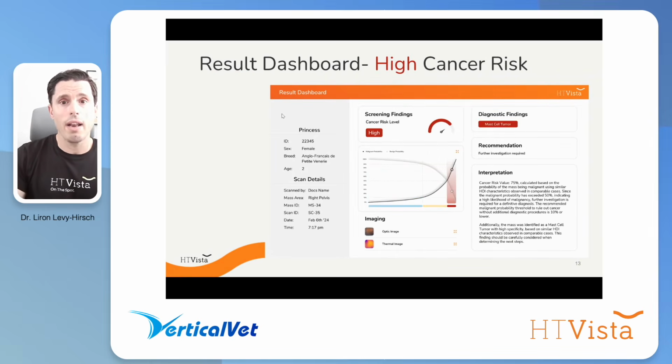I guess on the other line, we have this mass that's got a high cancer risk with an alert that potentially they are dealing with a mast cell tumor. So you can see how strong the message is that in this specific case, it's probably better to continue and do more tests, because there is a high risk.